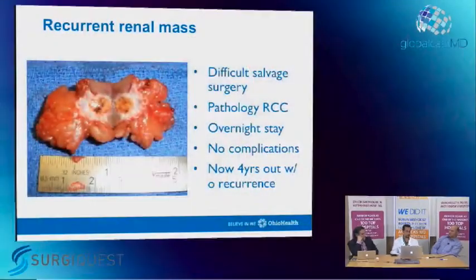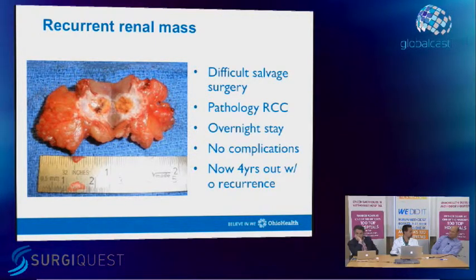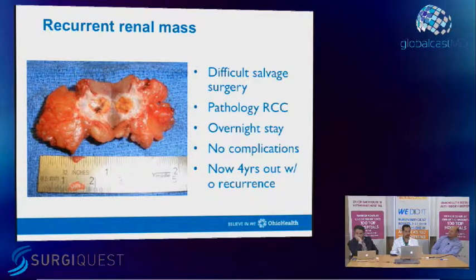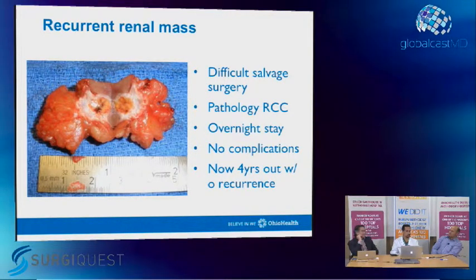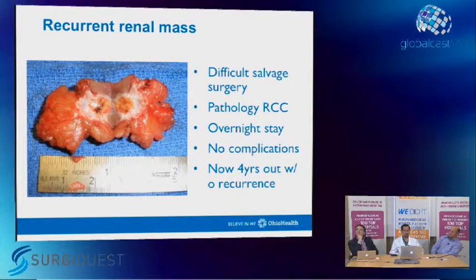I think this is the most challenging partial you can do. These are usually extremely stuck, at least in my experience. This patient was treated twice. It's very, very stuck all over, and you end up having to take more tissue than obviously a regular partial. That's exactly what we found. It was very hard to find. The fat around it was inseparable from the area of the tumor. It was like a complete endophytic tumor, so we relied completely on the ultrasound. So a very difficult salvage.